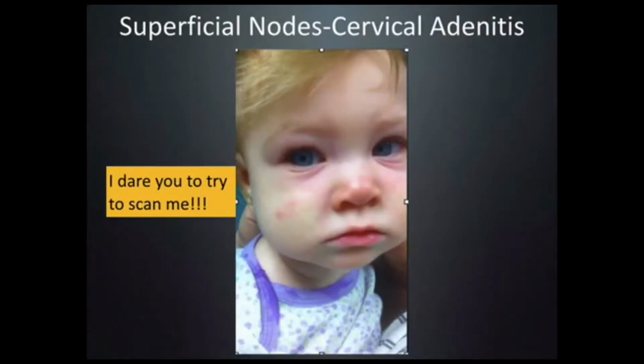Well, when I'm not busy doing ultrasound scanning in the developing world, this is where I work. I work in a university pediatric emergency department, and this is what my normal patient looks like. This is a young girl that came in with a high fever and swelling in the right side of her neck. And I was asked to see if she might have cervical adenitis or an abscess. And she's giving me that look like, you're not coming near me with that ultrasound probe.